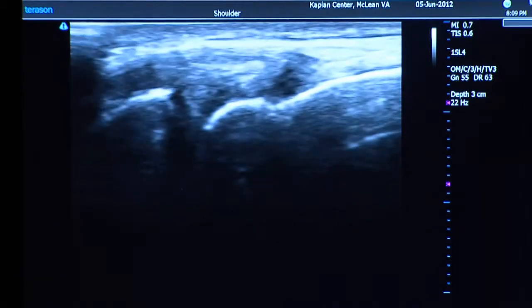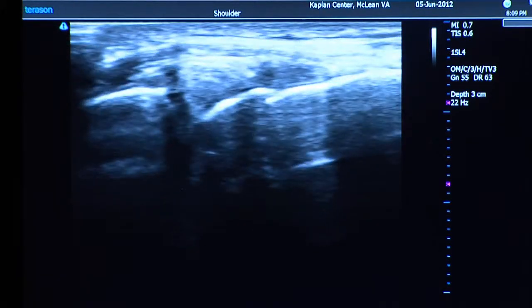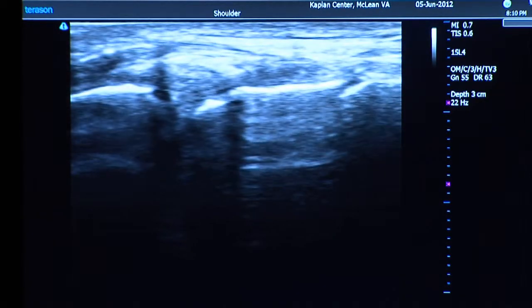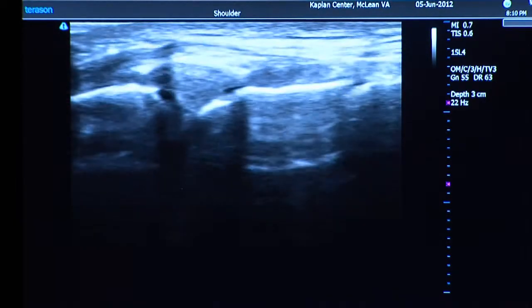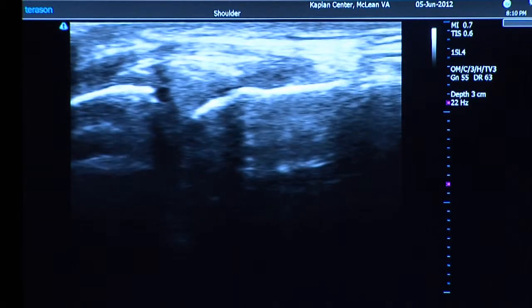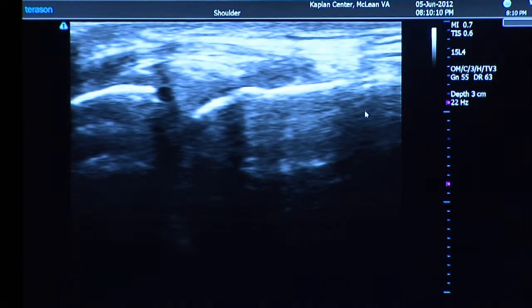I have to make tiny movements just to get the optimum image. All right — here is the femur or thigh bone, and beneath that you've got the shin bone, the tibia. The joint in between is the joint line right here, and this triangular piece is the medial meniscus right there. This is only a small portion of the meniscus that you can see.